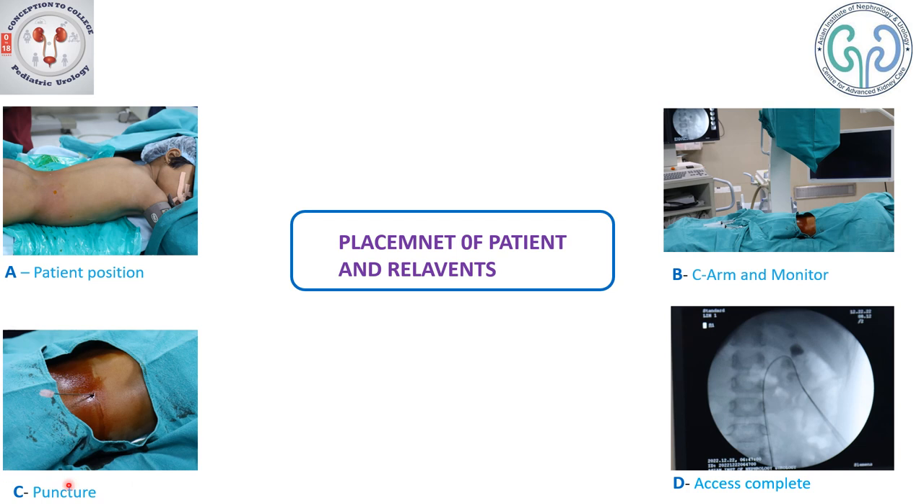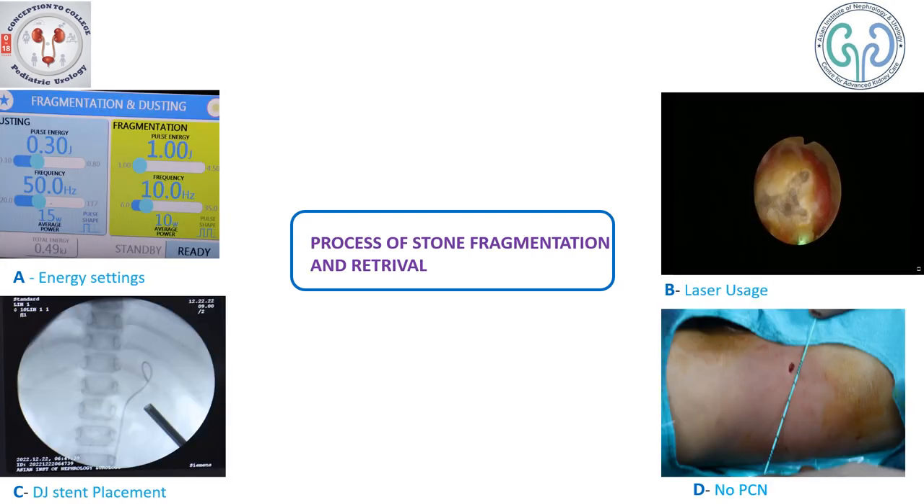With the posterior calyceal approach, here is the spine and here is the posterior axillary line. We prefer not to go anterior to the posterior axillary line to avoid inadvertent injury to the colon. Here you can see the access is complete with a lower pole approach — the guide wire is passing into the lower pole, into the pelvicalyceal system, and finally into the ureter. The tract is dilated appropriately; we have dilated the tract up to 16 French, and a 16 French access sheath was left in place.